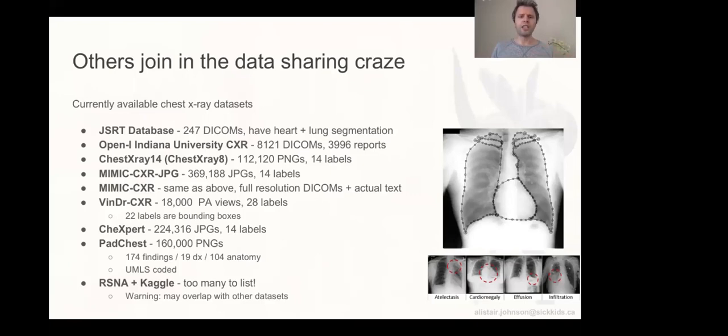So, there's actually a lot of data out there, slightly different formats, very important to consider the different resolutions and image data types. For example, some of these data sets actually come as DICOMs, right? And a DICOM is a very, very high resolution image, which also comes with metadata. It's a very standard format in medical imaging, but there are some interesting aspects of that high resolution.